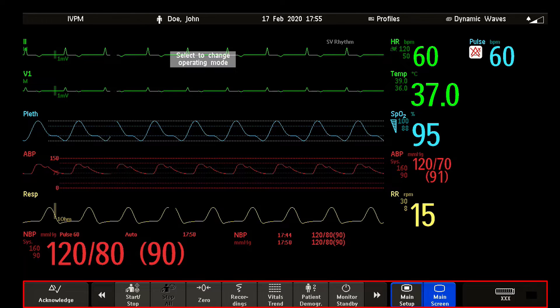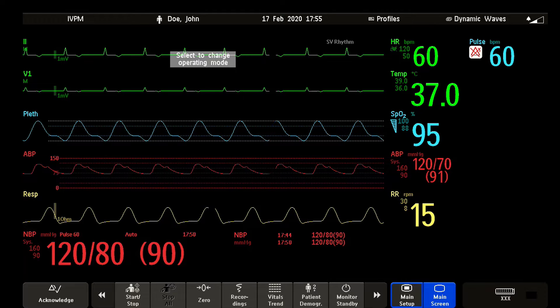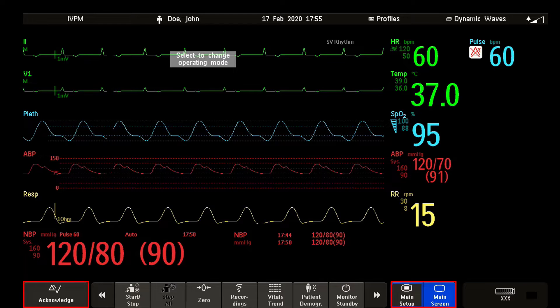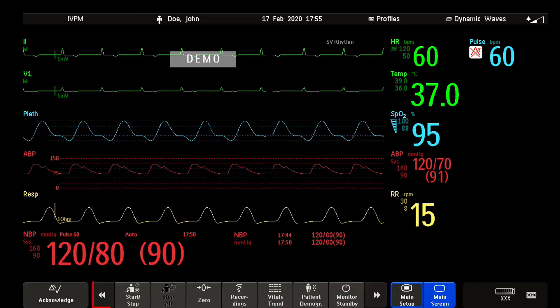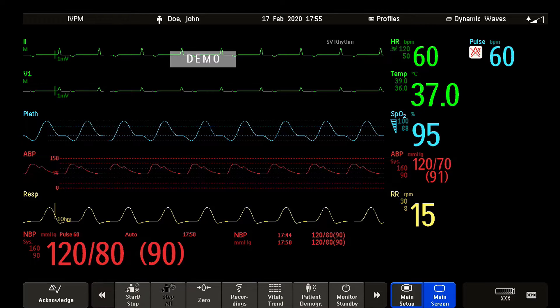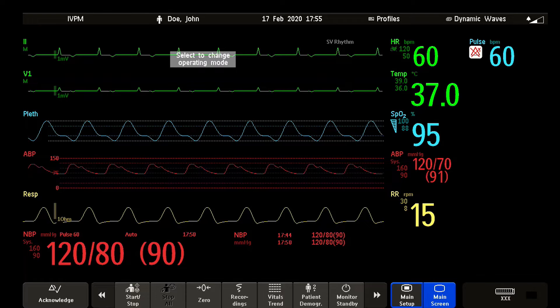These are the screen keys. Some keys are permanent keys like the main screen key, the main setup key, and the acknowledge key, while others are smart keys. Smart keys give you fast access to functions. You may also find some hard keys as physical keys on your monitor device — for example, to start or to stop a non-invasive blood pressure measurement.